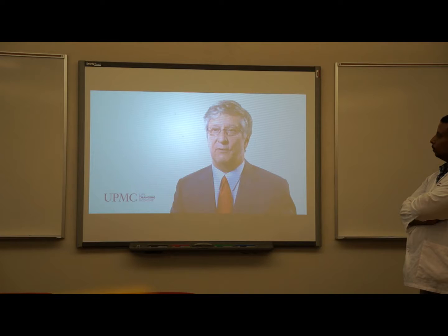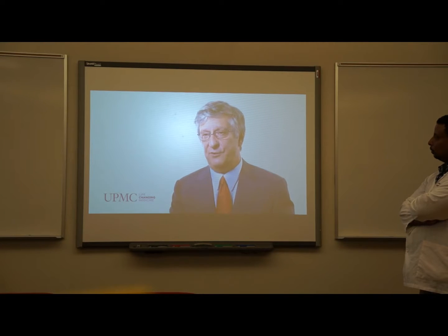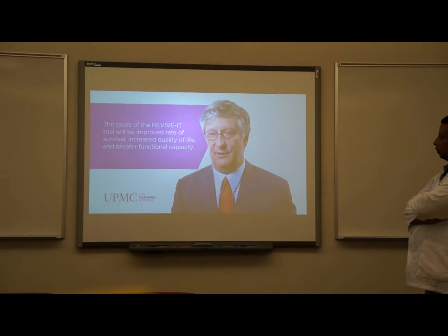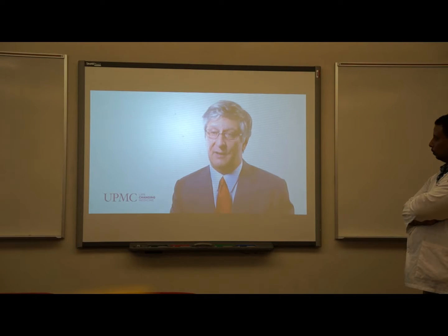Revive It is a multi-center randomized trial testing the efficacy of a left ventricular assist device in destination therapy, but in class 3 heart failure, which means we're putting it in patients much earlier. These patients must have heart failure for at least a year. They have to have stable class 3 heart failure for at least 3 months and cannot have more than one hospitalization in the last 6 months. So they're much more stable. However, they have to show limitations. Their ejection fraction has to be less than 35%, and they have to demonstrate that the quality of life is poor because of the heart failure.